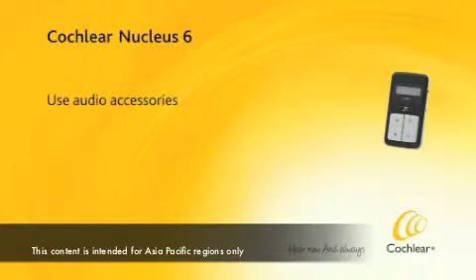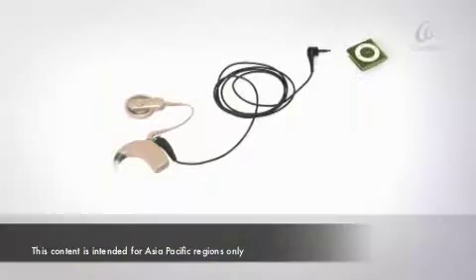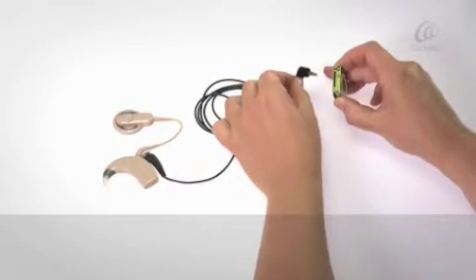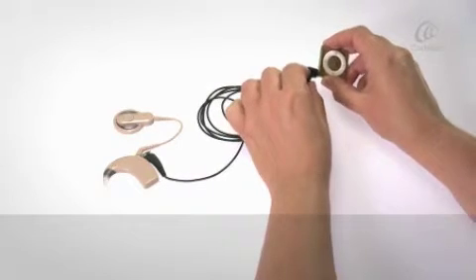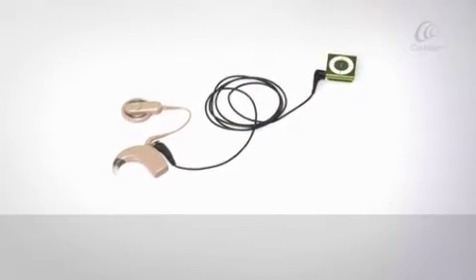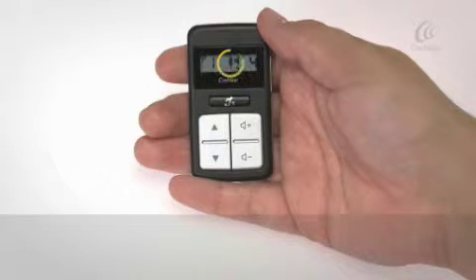Use audio accessories. When you connect an audio accessory to your CP910 sound processor, the accessory will turn on automatically and your remote control will display the accessory icon.